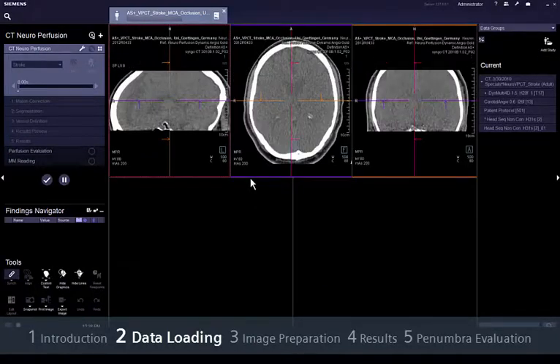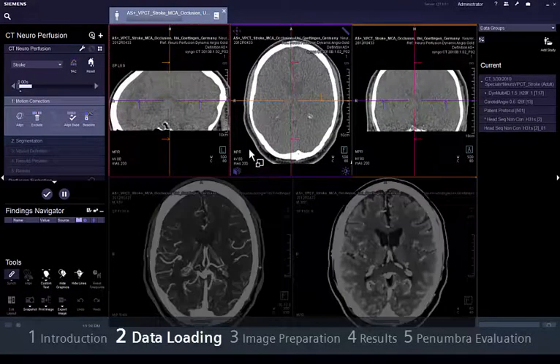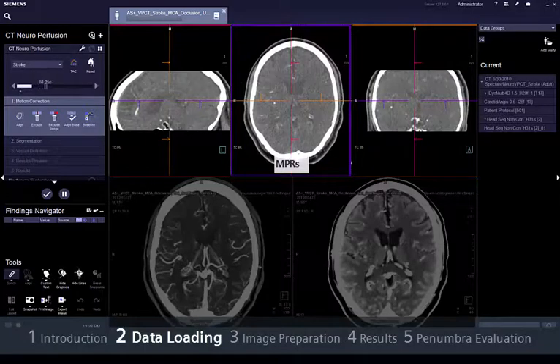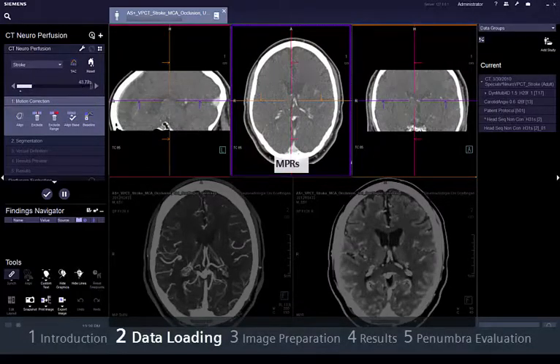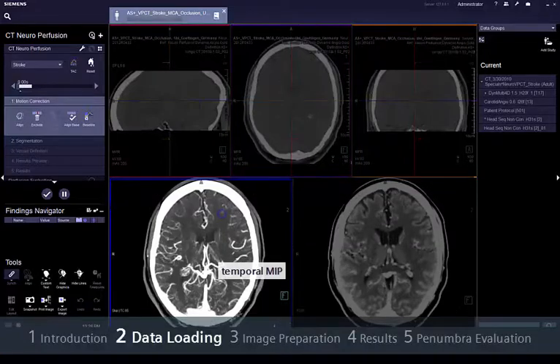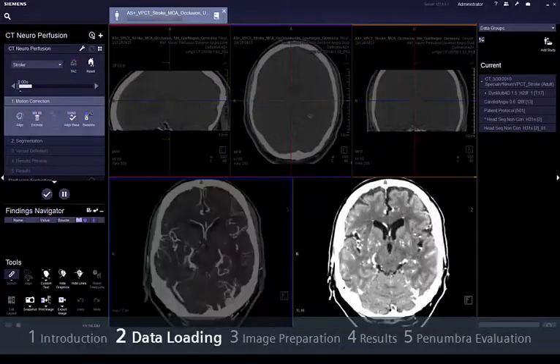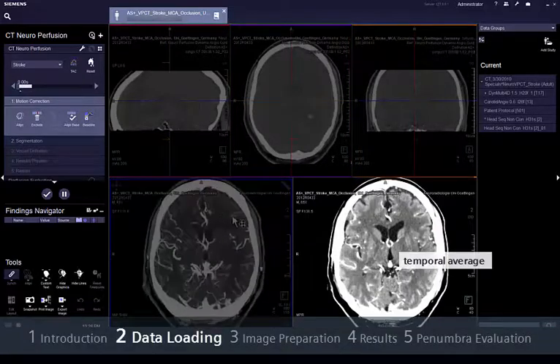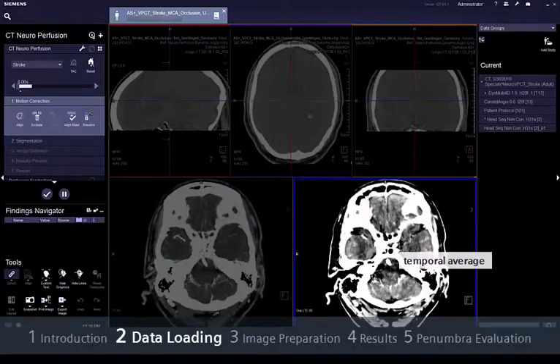The patient data will be opened in a layout that consists of the temporal data displayed with 3 MPRs at the top of the screen, a lower left segment with the temporal MIP for better assessment of the vessels, and a temporal average on the lower right segment for better assessment of the brain parenchyma.